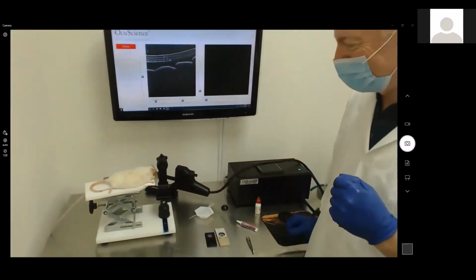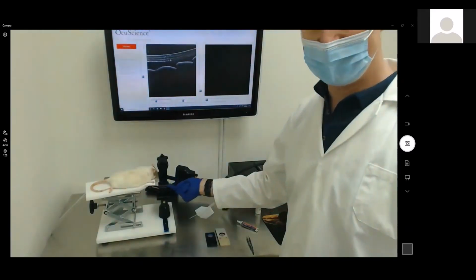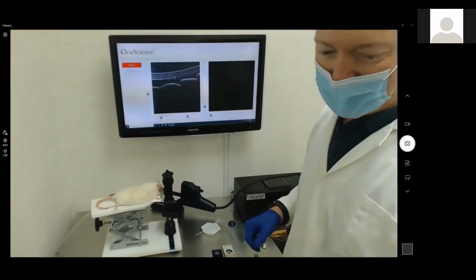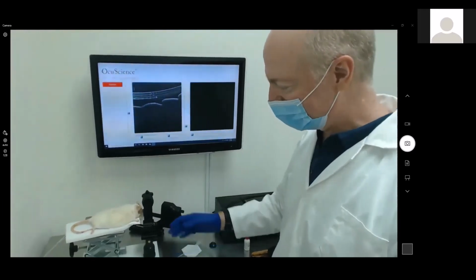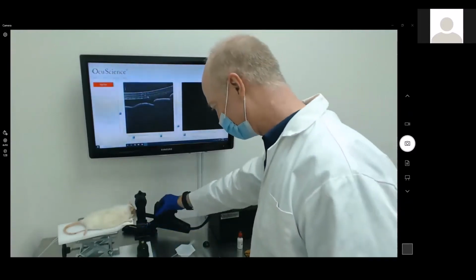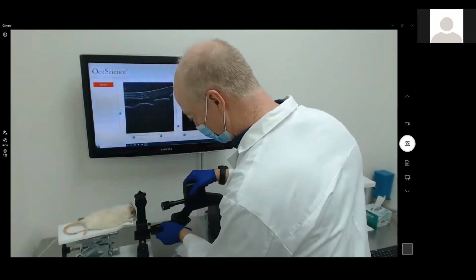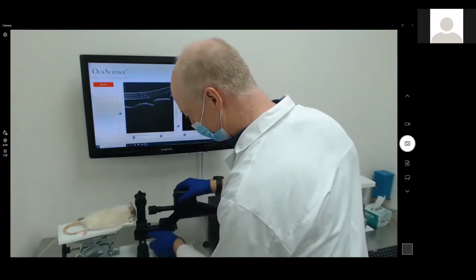All right, very good. The rat is now in our extra large size face mask, so you can vary those depending on the size animal you're working with. Now that we're going to do the OCT, we've already talked about the platform, so you can make all your adjustments for different animals, and then the gimbal for adjusting and positioning whatever imaging modality. This time we had the fundoscope, and now we're going over to the OCT.